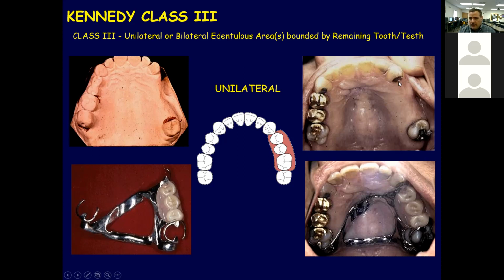These will prevent decay and prevent pressure on the teeth. That's one of the differences between partial denture and complete denture. Complete denture, there are no teeth, while partial denture, there are teeth, and we make modifications on the teeth, especially the teeth that carry the clasp or the rest or these connectors that connect the partial denture.